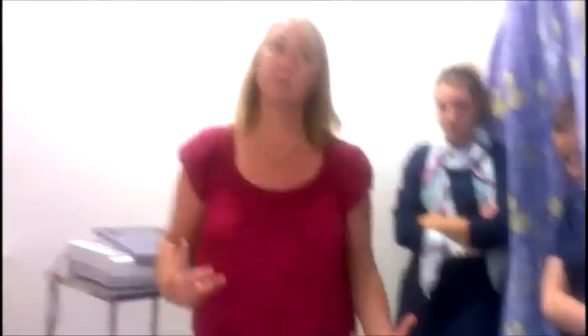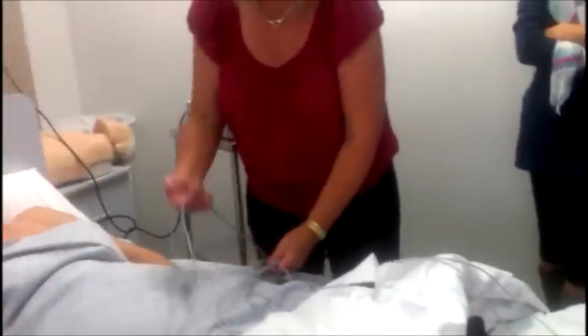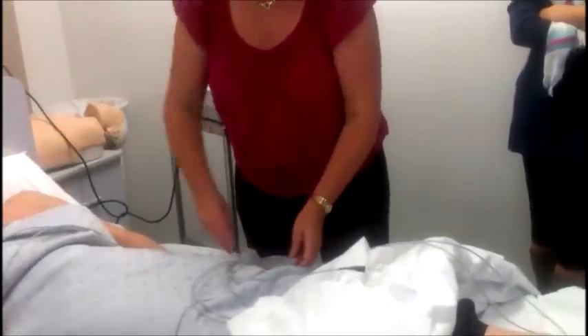I like to do the limb leads first so that I'm not exposing the chest for longer than necessary. I'll untuck the blankets so that only the feet are exposed rather than pulling it all down and leaving them cold — especially in a cold room. So there are two limb leads here and two limb leads there, and then the chest leads.